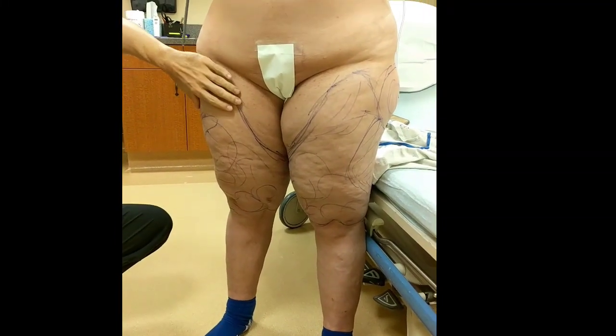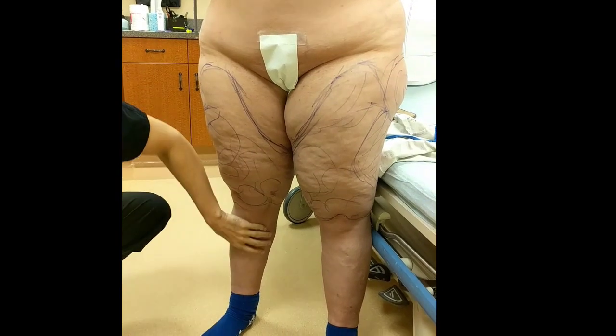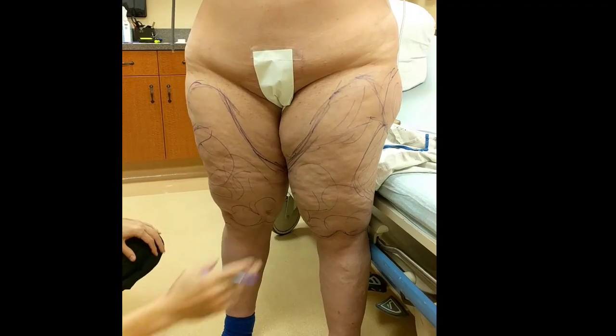Alright guys, we're just about to get started. We're going to do the lipoedema liposuction of the upper legs. We've done the lower legs, so they're a lot smaller now. We're going to go up all this way and up around the back on both sides.